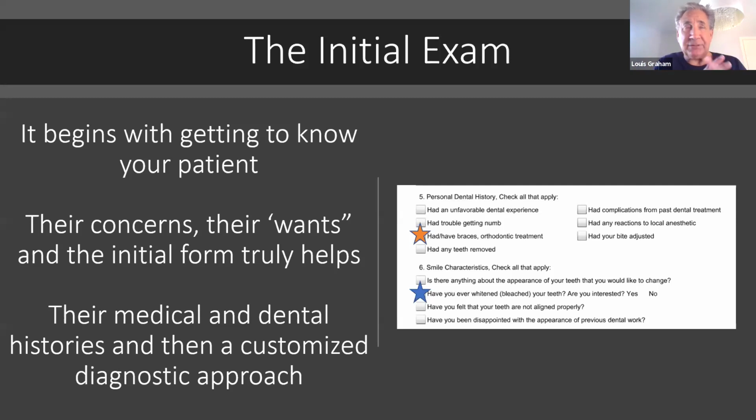So almost 10% of our new patients last year, 46, had external or internal resorption. And what's amazing is that external resorption is routinely caused by some trauma to the periodontal ligament. And the number one cause is ortho. So as you get a cone beam and you're looking at a history of ortho, it could have been 40 years ago, you want to be looking for resorption.